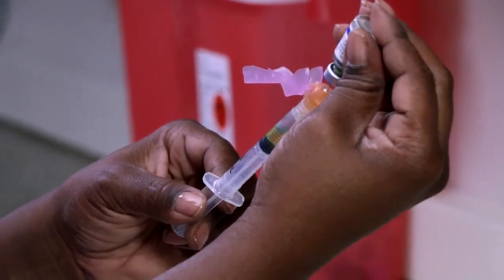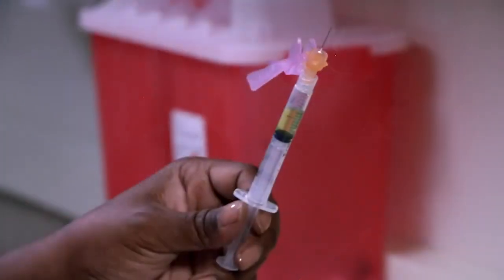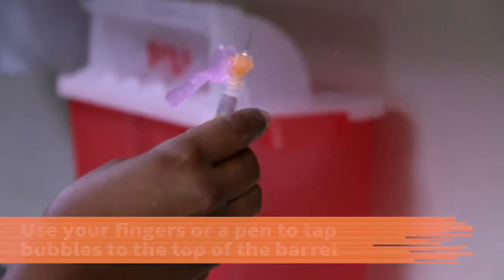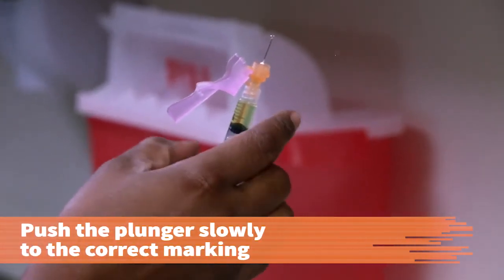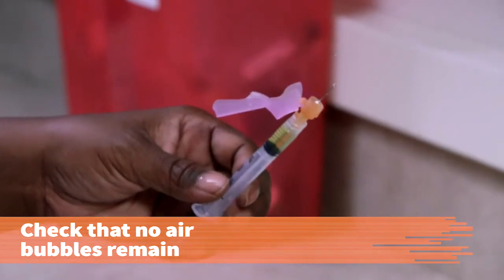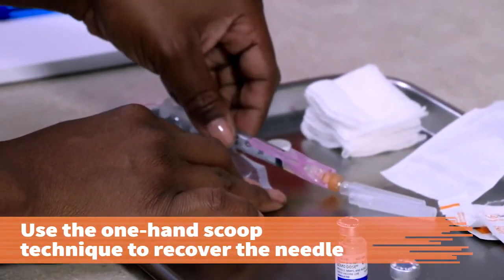Continue to hold the vial and syringe unit vertically, with the needle pointing upward in your non-dominant hand. With your dominant hand, either use your fingers or a pen to tap the bubbles to the top of the barrel. Once all the air bubbles are at the top, push the plunger slowly to the correct calibration marking for the ordered dose. Double check that no air bubbles remain in the syringe and that the right dose was measured. Use the one-hand scoop technique to recover the needle.